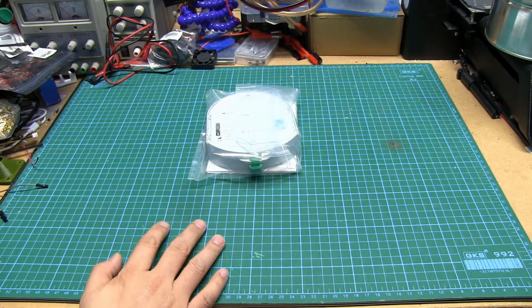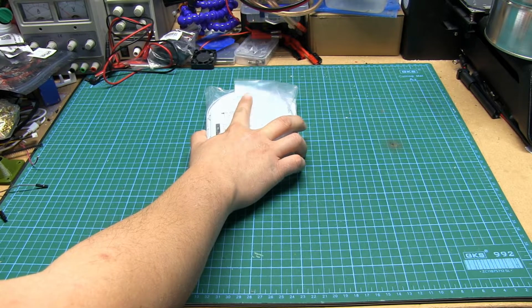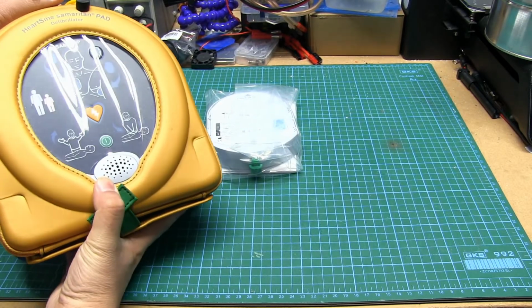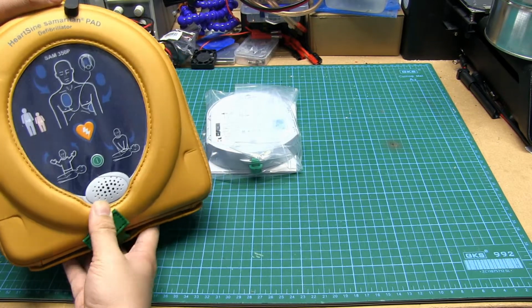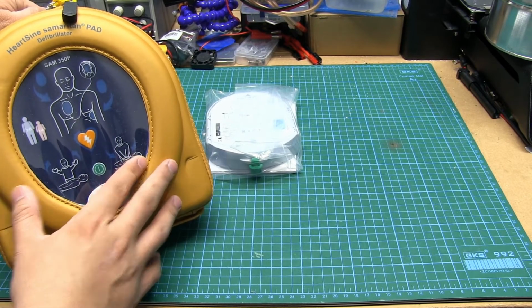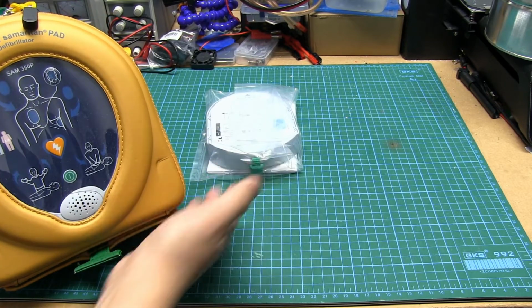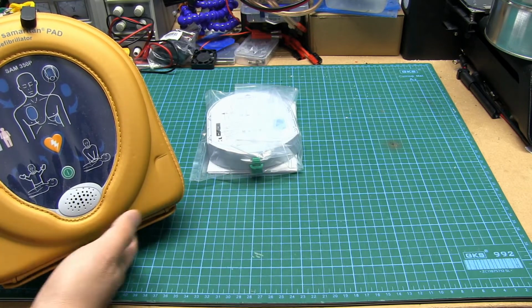Hey YouTube, today's teardown video is going to be about the automatic external defibrillator pad pack. This is for the Heartsine SAM350P defibrillator that you saw in a previous video where we put a char mark on the bench and managed to trick this thing into discharging. Either way, I've gotten a replacement pad pack for the expired one. We're going to tear into that and see how it's built, see if we can learn any tricks from it, or if it's very similar to other pad packs.